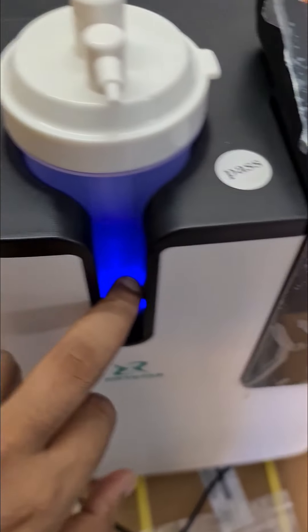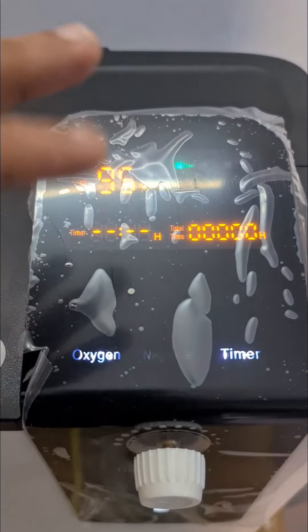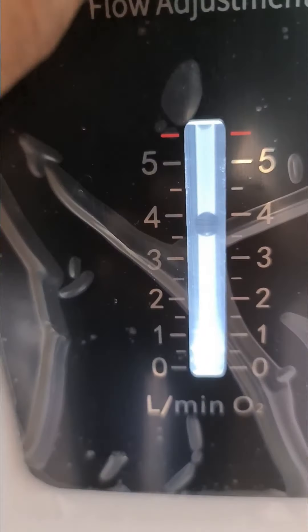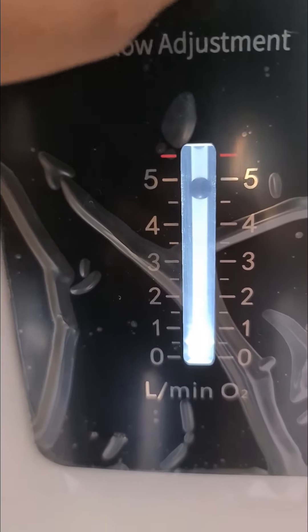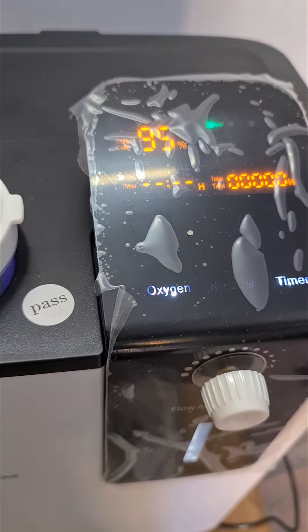See how he is inserting the humidifier — it has to be inserted in this position only. Press it firmly. Automatically you will see the bubbles in the humidifier, and then you can connect the cannula. After a few seconds it has come to 95%, and the flow rate is at 4. You can even take it up to 5. Whatever flow you keep, the concentration will be the same.